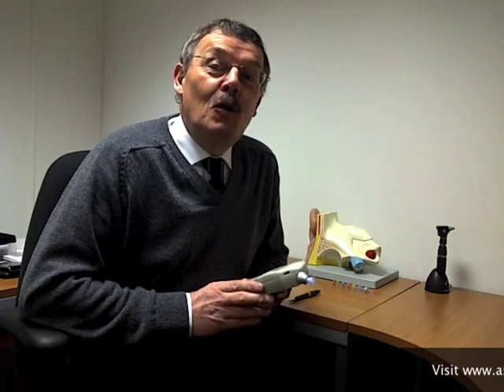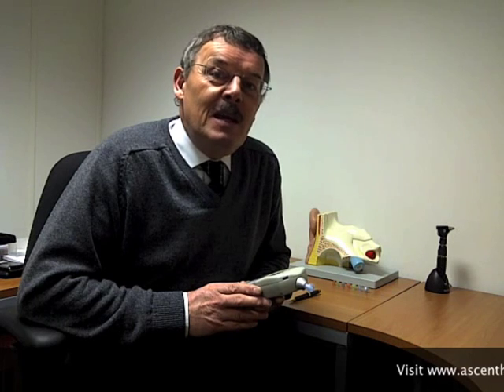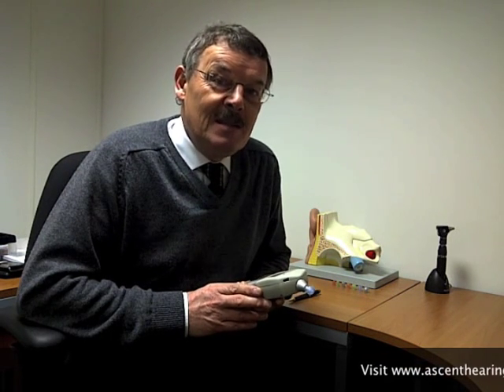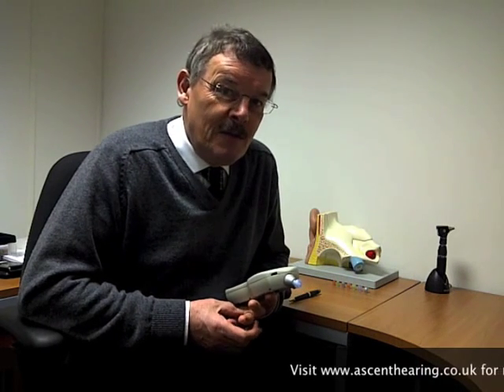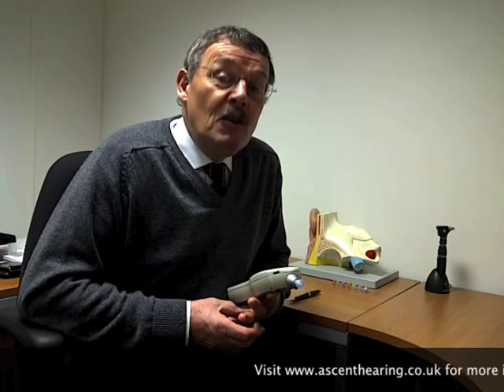Historically it was also called impedance testing. And what it basically does, it measures how well your conductive pathway is passing sound through to your inner ear. Now, most of the pathologies, most of the problems that arise with our ears, if there's an abnormality in the conductive pathway, they tend to cause changes in stiffness of your ear.